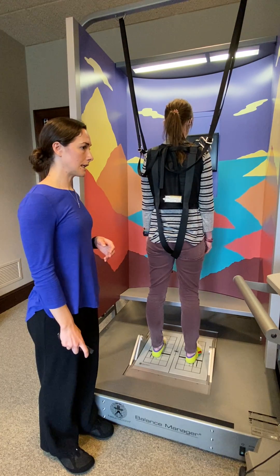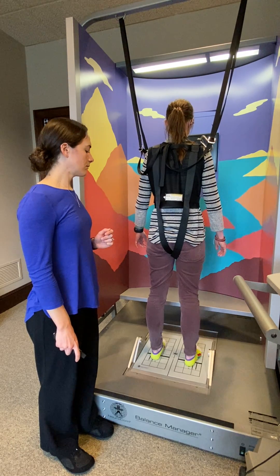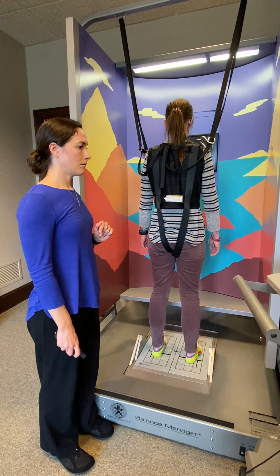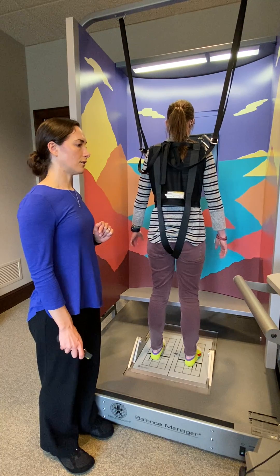Jill, are you ready? I'll begin the test starting now. And it'll do that three times. I'll stop the test.